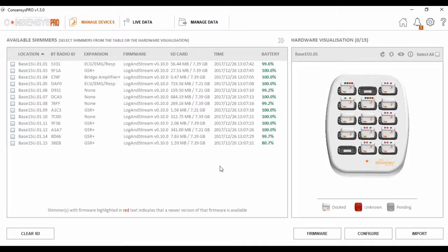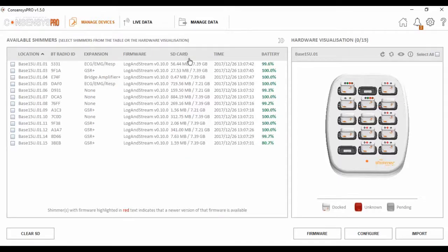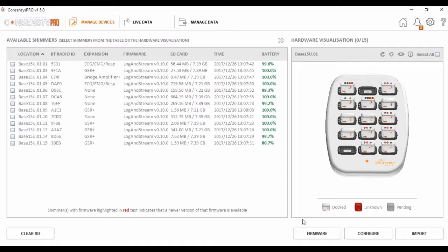Today we are going to collect both logged and live data from the Shimmer3 GSR Plus device. The Shimmer3 GSR Plus has an inbuilt SD card for collecting data and also has Bluetooth capability for streaming data live.